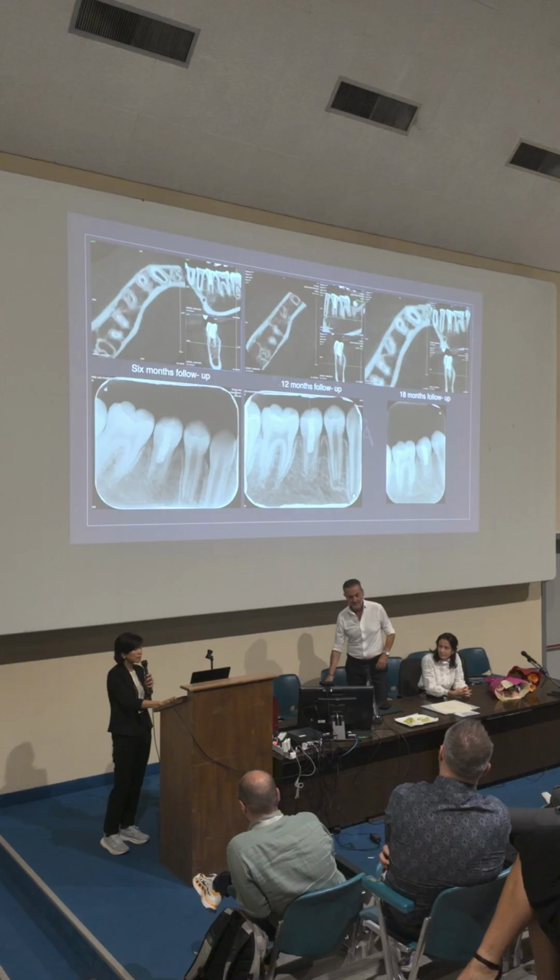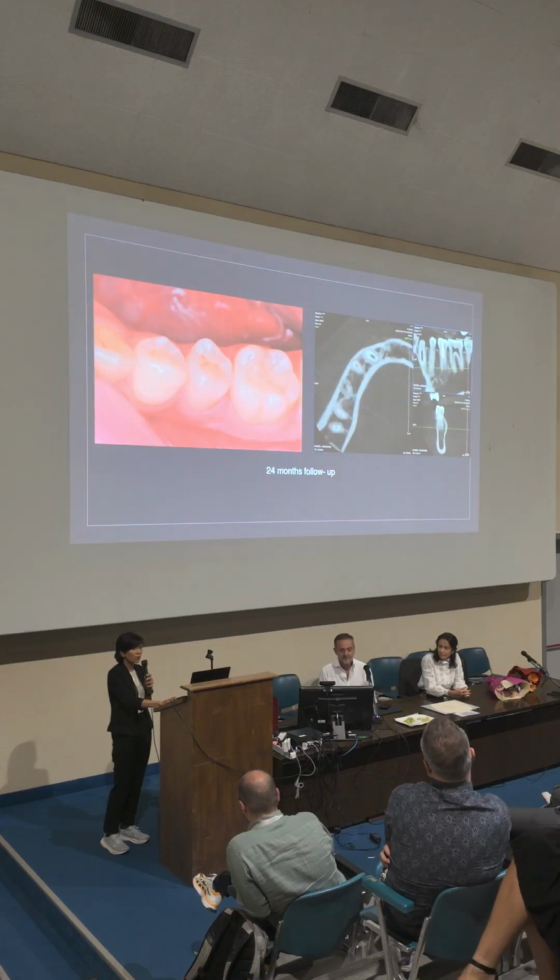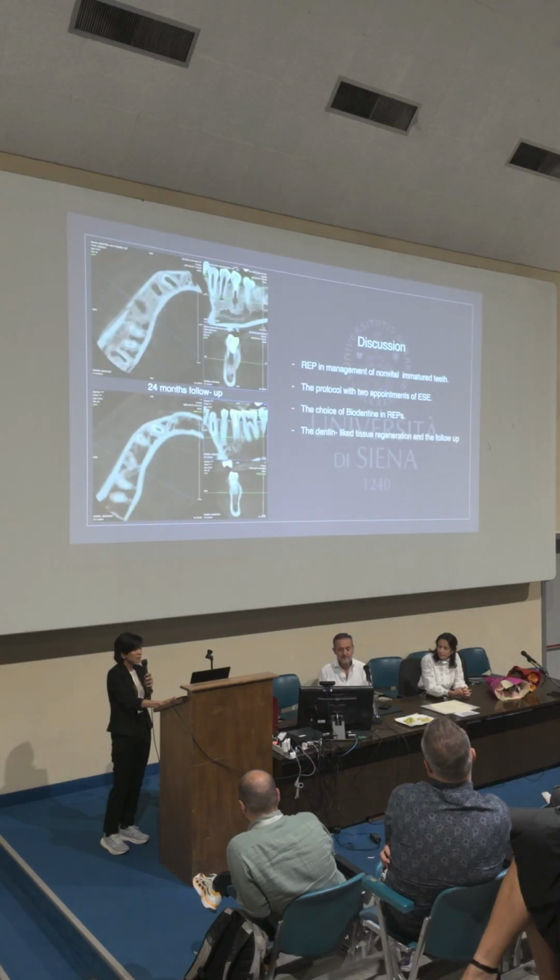And this is the result after 6 months, 12 months, and 18 months. And this is the 24 months. So you can see in comparison to pre-operative and after 24 months.